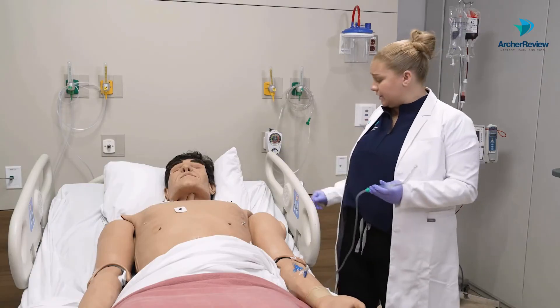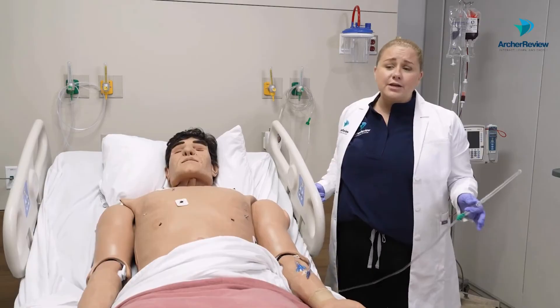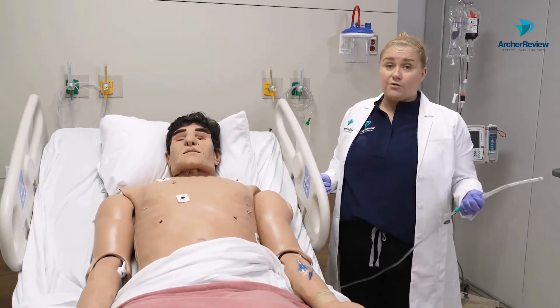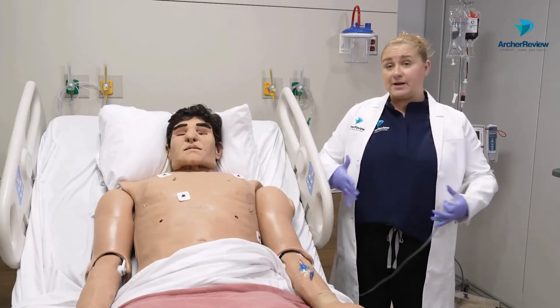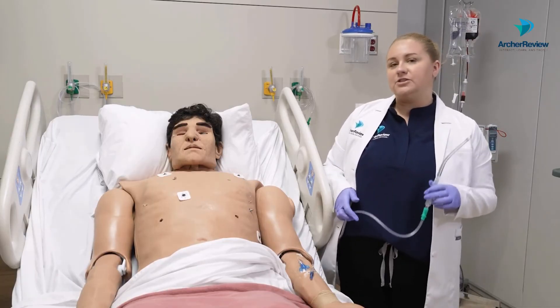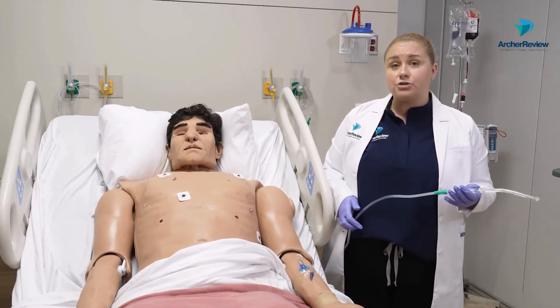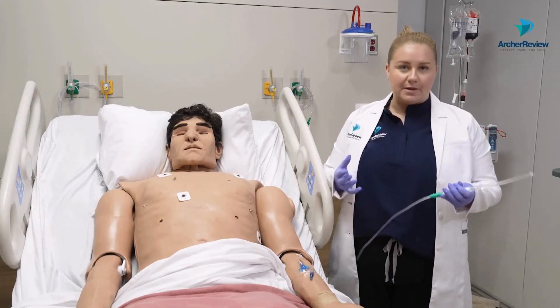Then we'll go ahead and raise our client up for respiratory care. Overall, the higher they're sitting up, the better lung expansion we are going to have. Oftentimes we'll do suctioning after chest physiotherapy or nebulizer treatments to try and clear out any gunk that's built up in their lungs.